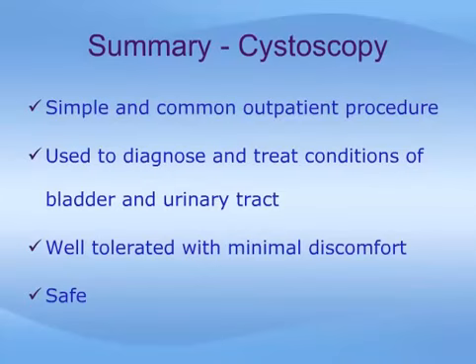In summary, cystoscopy is a simple and common outpatient procedure used to diagnose and treat conditions of the bladder and urinary tract. It is well tolerated, causes minimal discomfort, and is associated with minimal risk.